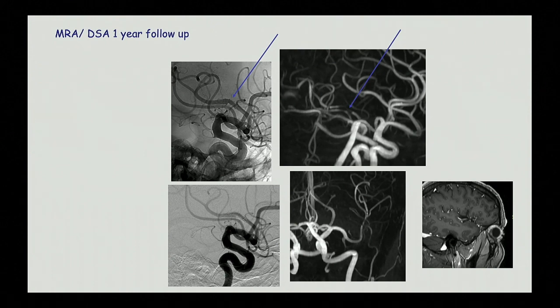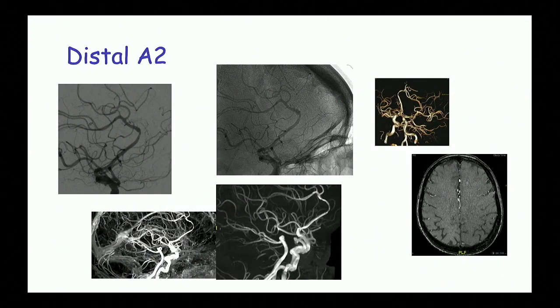And another case with distal implantation. This is Vista Baby from BALT. A very soft device. It's very well seen, very easy to place, and it was placed inside the distal branch with a good result.